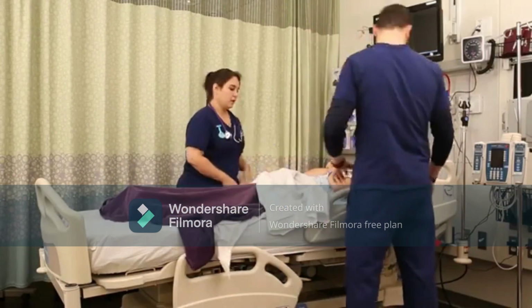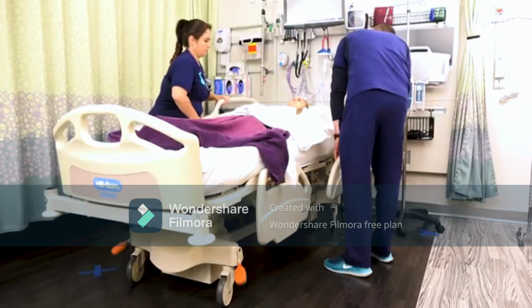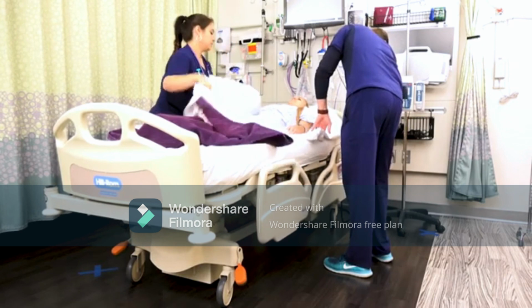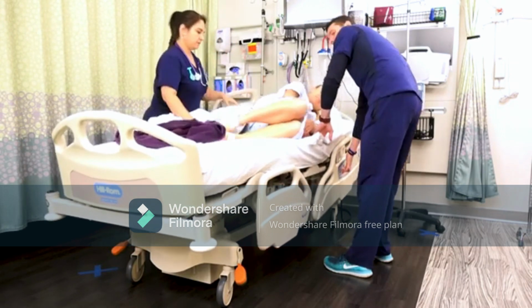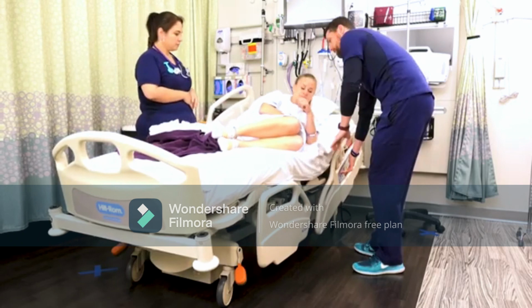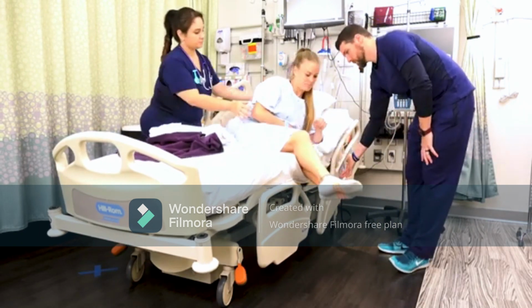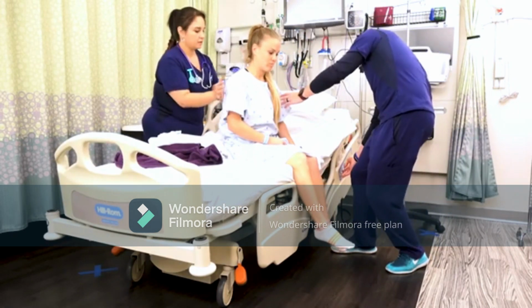Now, let's say we want to get the patient out of bed. First thing we need to do is put the side rail down and have the patient turn towards you onto their side, and of course put the bed down lower to the ground. Once we're ready, we want the patient to lift themselves up onto their elbow, and then they want to turn up to sitting as they swing their legs over the side. And you can help them move their legs if needed.